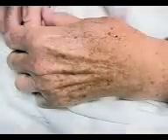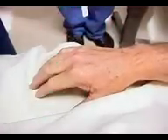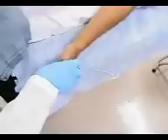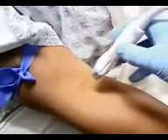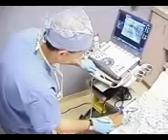When a vein is difficult to see or to identify on palpation, several methods can be used to increase its dilatation. These include lowering the arm below heart level, gently tapping on the vein, instructing the patient to open and close his or her fist repeatedly, and applying a warm compress to the selected site for 3 to 5 minutes to increase vasodilatation. Transillumination or ultrasound may also be used to help locate a vein. These have been shown to improve the success rate of the procedure and to reduce the amount of time needed to perform it.